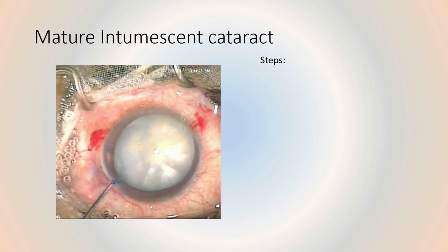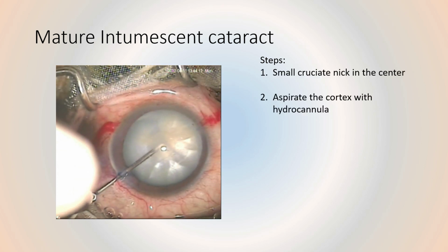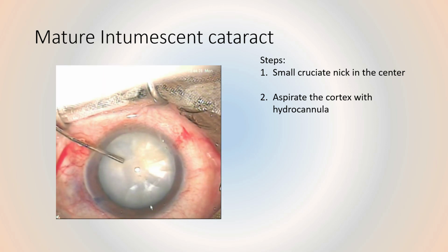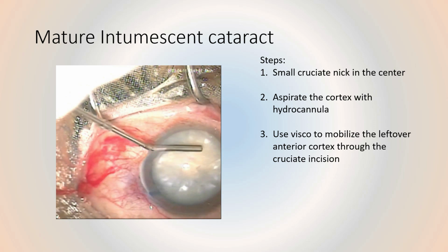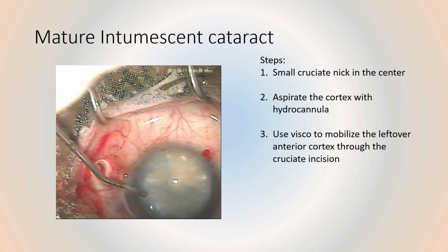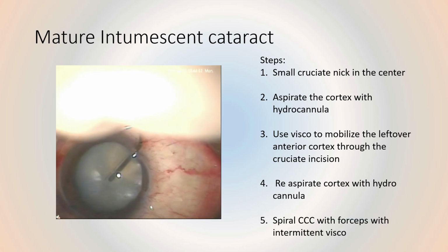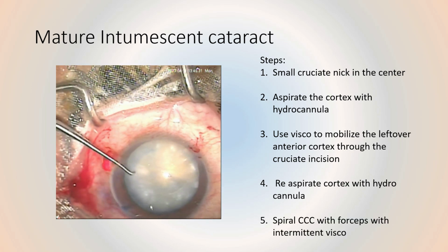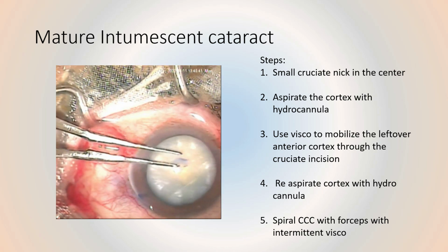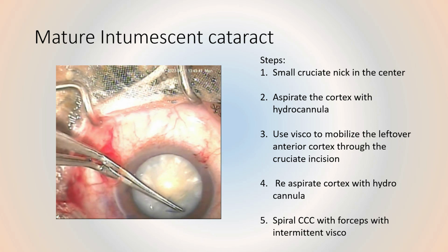What are some special situations, like mature intumescent cataract? In this, a small cruciate nick in the center is to be made. Aspirate the cortex with a hydrocannula. Use viscoelastic to mobilize the leftover anterior cortex through the cruciate incision. Re-aspirate the cortex with the hydrocannula. A spiral rhexis with forceps with intermittent viscoelastic injection is the way to go. We can do the rhexis with either Utrata forceps or microrhexis forceps.